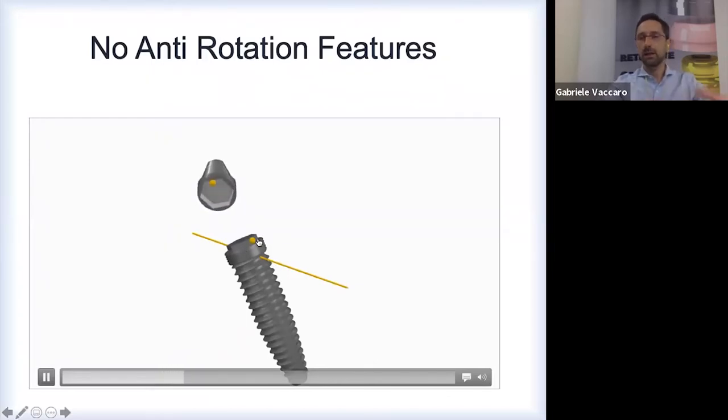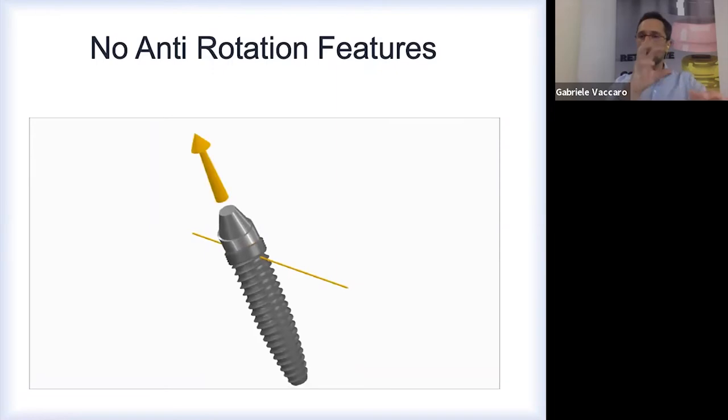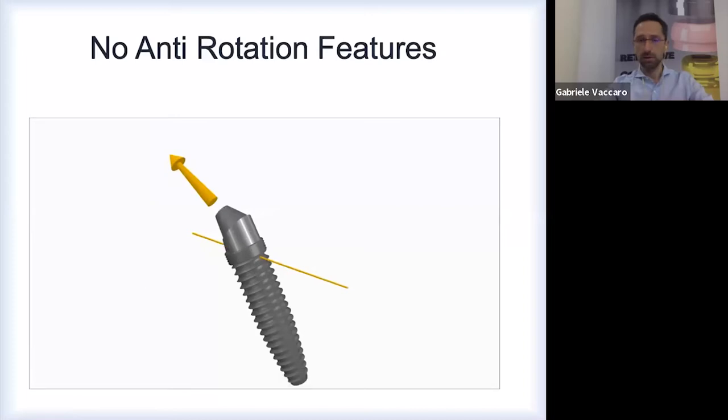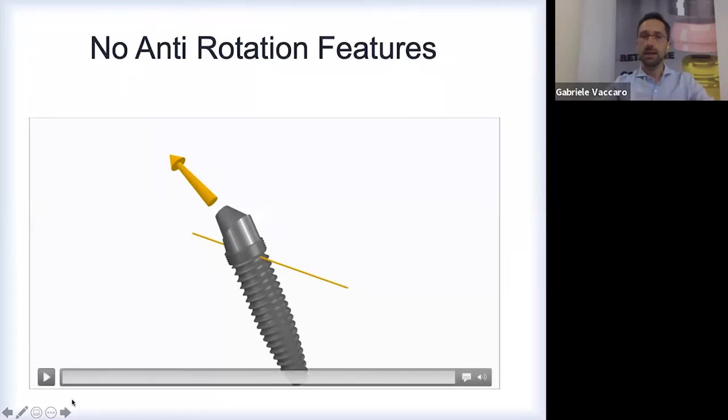So if during the surgery we need to put the implant deeper, we have to rotate the implant a little bit more, a quarter of a turn or a bit more. Or we need more primary stability, so we have to screw it in a little bit more. Or we feel that we are using too much strength, too much torque to screw in the implant, and we need to stop before it comes to the right place. So having an anti-rotation system can be an obstacle for the prosthesis. Since we have a complete round sphere, we can overcome this.